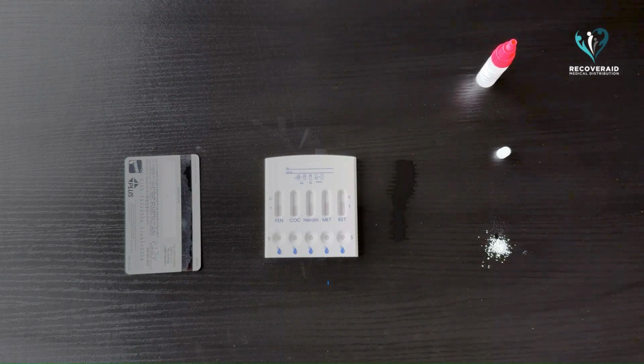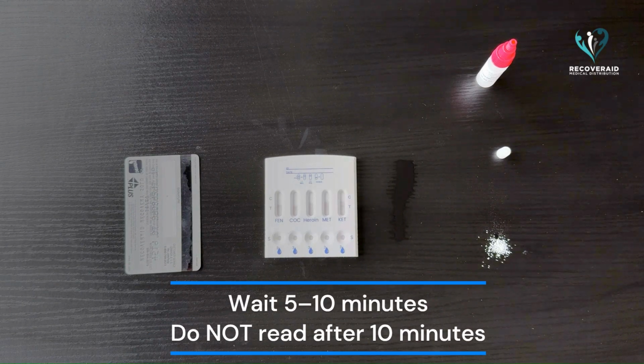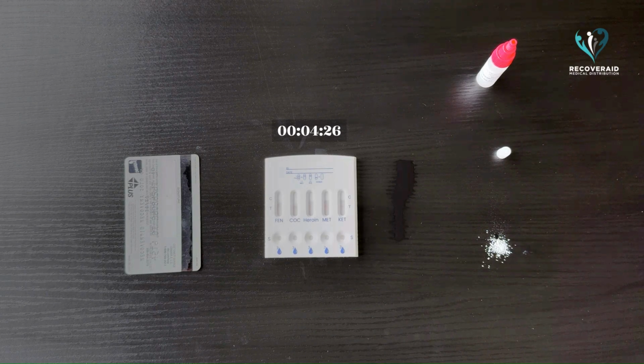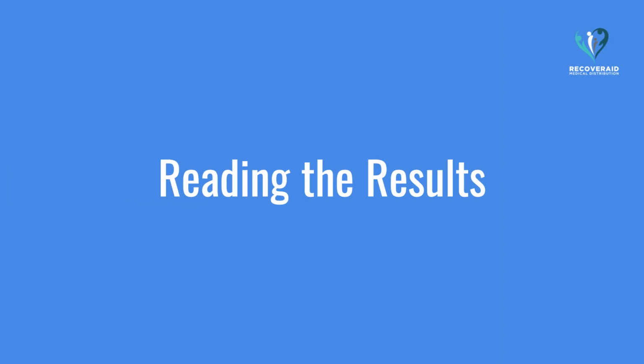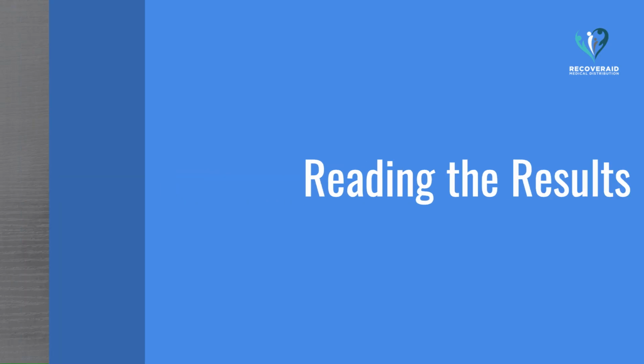Allow the test to develop for 5 to 10 minutes before reading the results. Do not interpret the results after 10 minutes. Once the appropriate time has elapsed, you're ready to interpret the results.